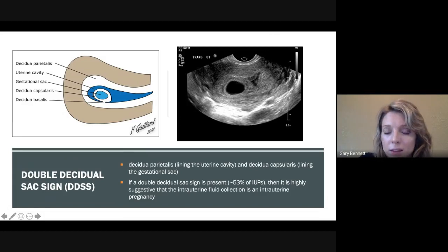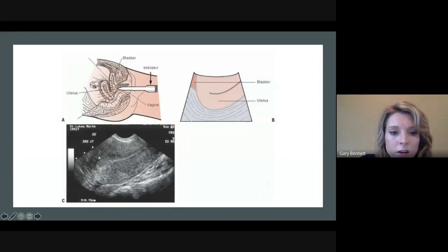But now we can see that there. We see a bunch of bowel around the edges there. Nothing too exciting here. Okay, so now that we're used to looking for fluid, there's some fluid right down there. Not something too concerning because it's just trace fluid, so I wouldn't be worried about that.